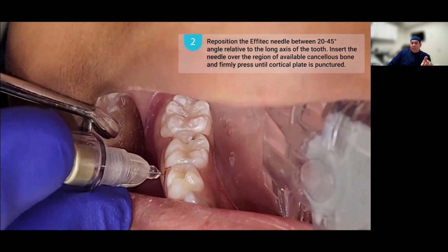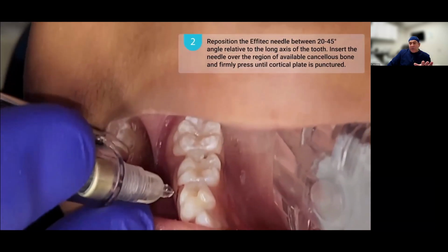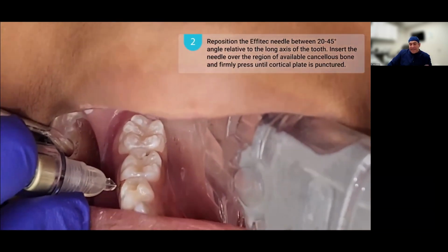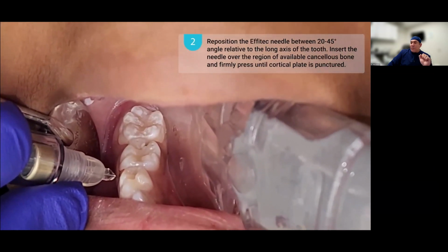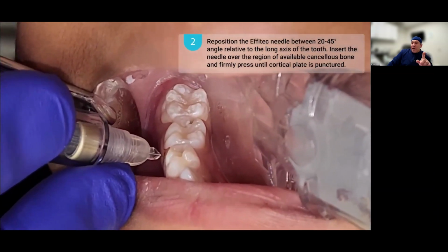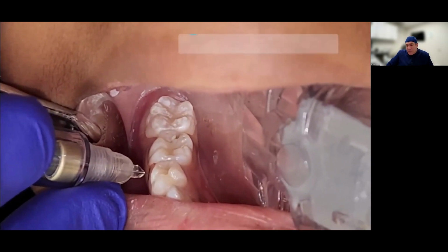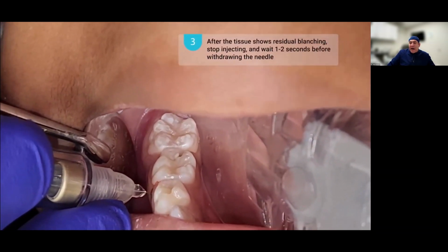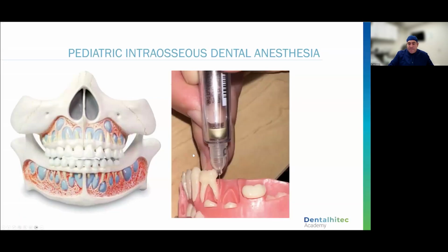Now, I want to make one point with this video. You notice how he didn't have his hand resting on the teeth. When you're delivering your local, I want you to position things a little bit differently. I want you to make sure you have a finger rest on these teeth. One of the main reasons why people bend needles is they don't have the correct position. They don't have the correct finger rest. And we're going to talk about that here in a little bit.